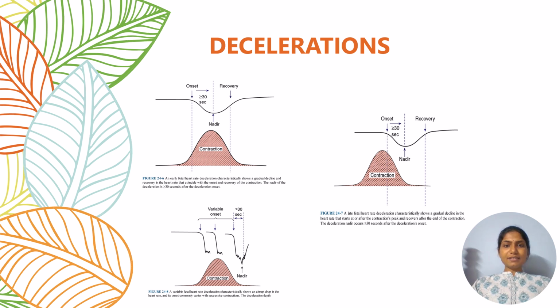Now let's discuss a little more about the types of decelerations. This is very important during labor. There are three types of deceleration. The first one is early deceleration. The second one is variable deceleration. The third one is late deceleration.